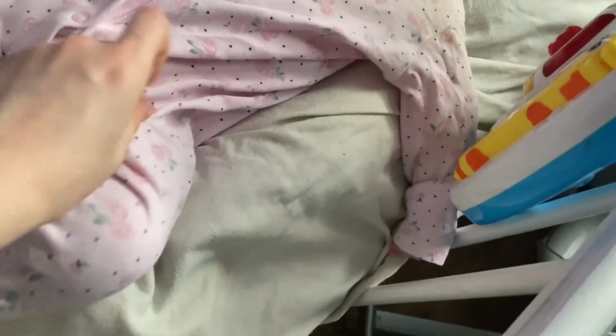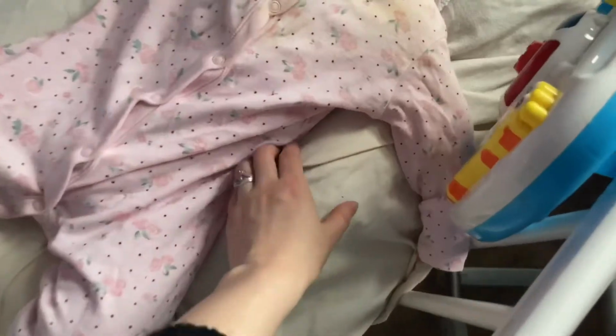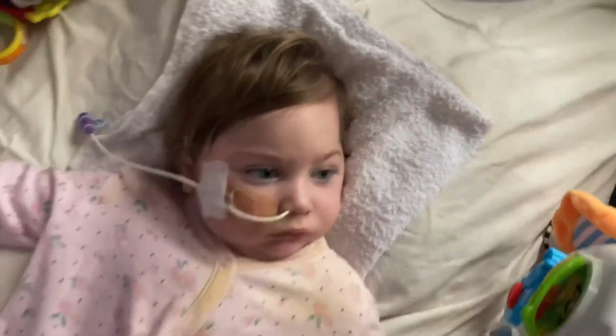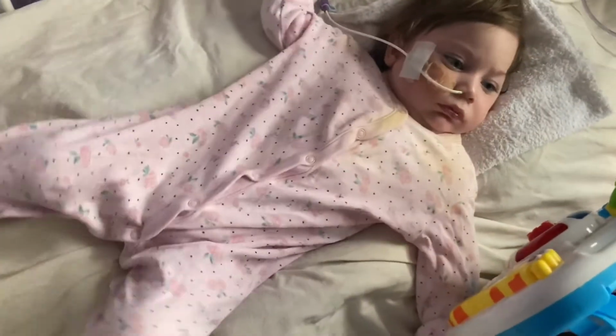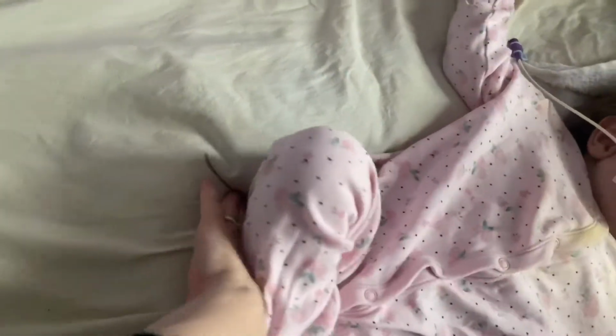Has pads either side, and it helps keep her back straight again, so that her back doesn't get too curved. It also helps bring her shoulders in with having tight muscle tone. It pulls the shoulders back so their arms are like this all the time, and as you can probably imagine, that gets quite uncomfortable. So this sleeping system helps bring her arms closer to that midline, and it also helps support the hips, all that kind of thing.